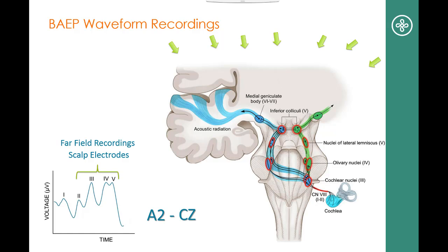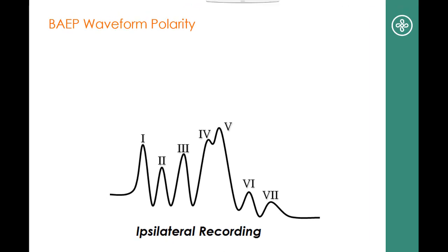Otherwise, if both electrodes were located on the scalp, the differential amplifier would subtract the information from itself and the output would be 0. It just so happens wave 1 is best recorded from an ear electrode like A1 or A2, whichever is ipsilateral to the stimulus, and those electrodes work for us as non-cephalic reference electrodes when we record brainstem responses. And finally, what's the polarity of these waveforms?